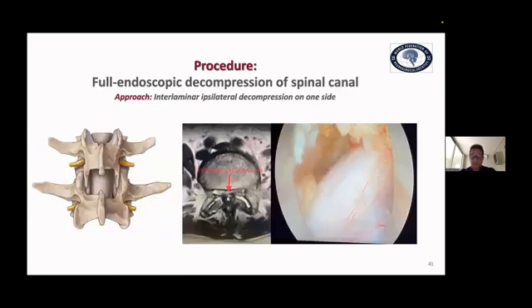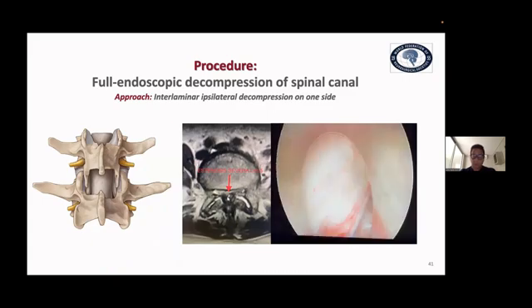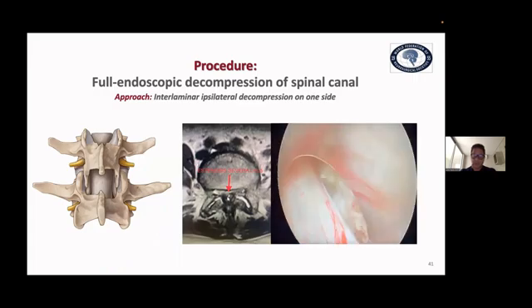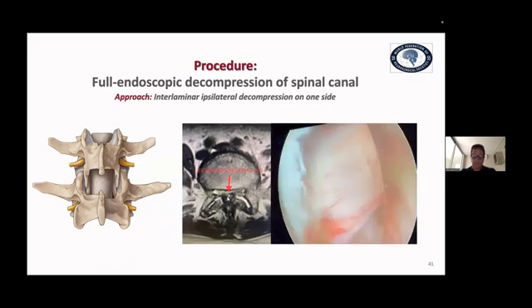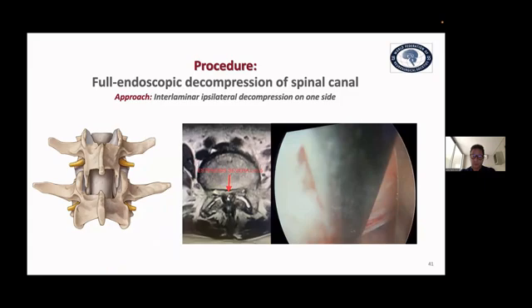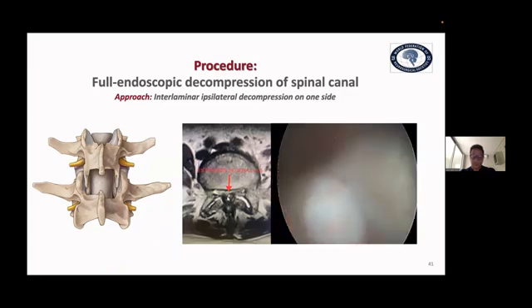This is a short video. It's an example of how you can perform surgery for severe stenosis using endoscopic spine surgery. It's possible to perform a bilateral decompression, as you see. Absolute decompression, over-the-top decompression. It's a surgery that takes approximately a couple of hours, but you can perform really complicated multi-level over-the-top spinal stenosis decompression with this kind of approach without any problem.